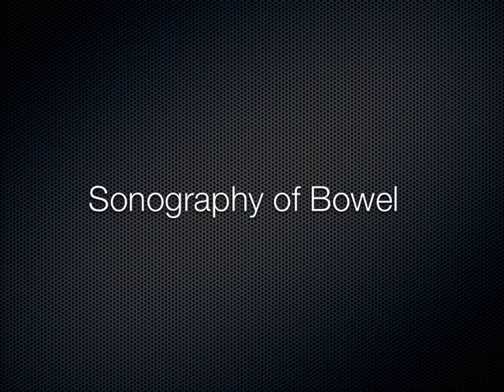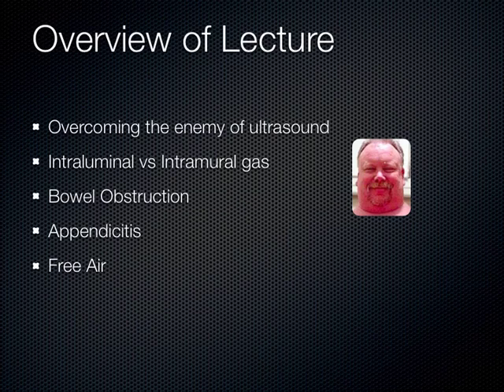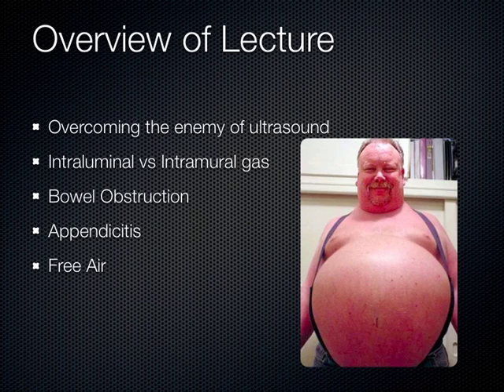Now, you talk about ultrasound of the bowel. Well, first, right off the bat, I know that you know who the enemy of ultrasound is, right? Who's the enemy of ultrasound? Air, bowel gas, generally speaking. And so that's the problem. In some patients, it's pretty significant how much bowel gas they can have, right? So we have to somehow overcome that enemy.